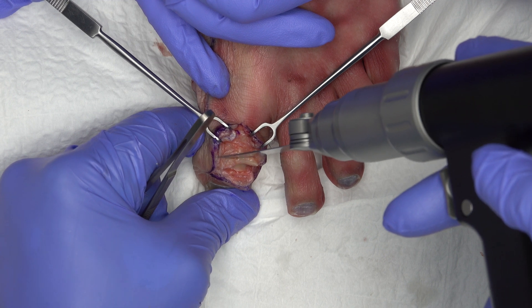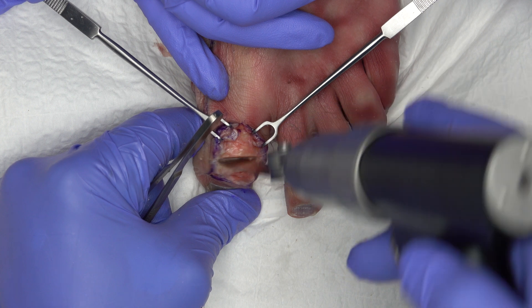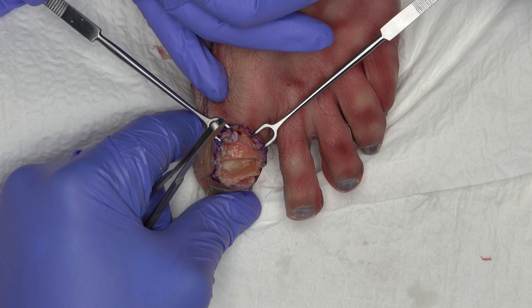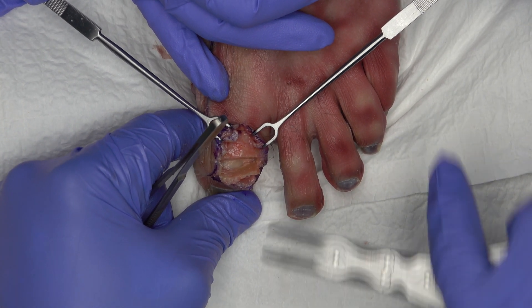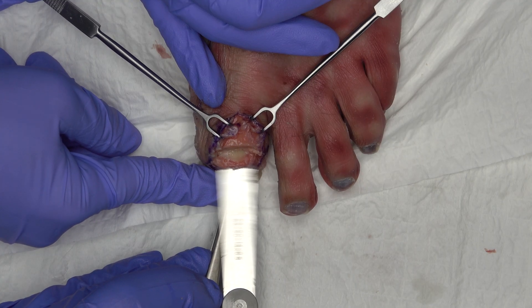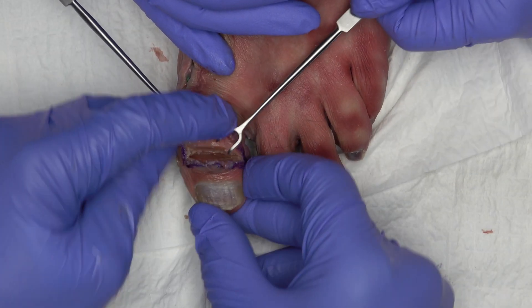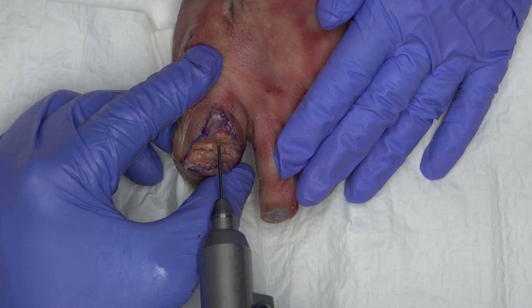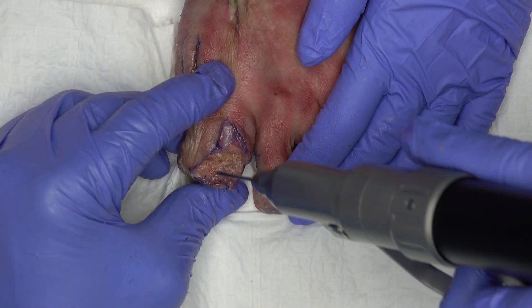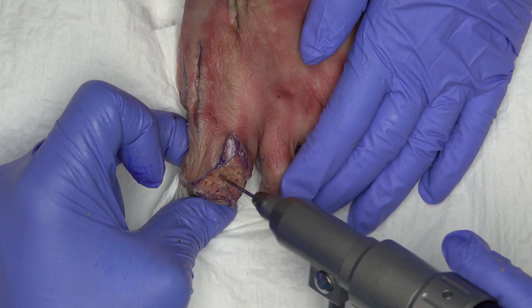The exophytes are removed under maximum plantar flexion. The base of the distal phalanx and the trochlea are then resected sparingly with the oscillating saw until the former joint surfaces can be placed flat on top of each other. Care must be taken to carefully remove any remaining cartilage after resection. The subchondral sclerotic bone is then micro-fractured with a 1.0 mm to 1.5 mm thin drill.